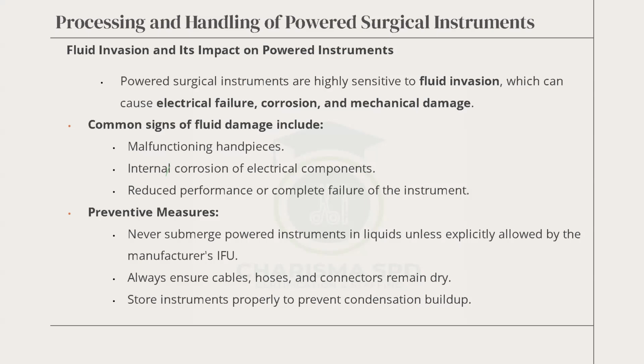Hoses have lumens in them, and water is not supposed to go into them. So you're not supposed to immerse them. All right. Be mindful. Store instruments properly to prevent condensation buildup. So you have to store them in the right and proper way so that they will not build up any condensation of any sort. You will get to know the hoses, or we might see them along the line in the picture somewhere in our discussion.